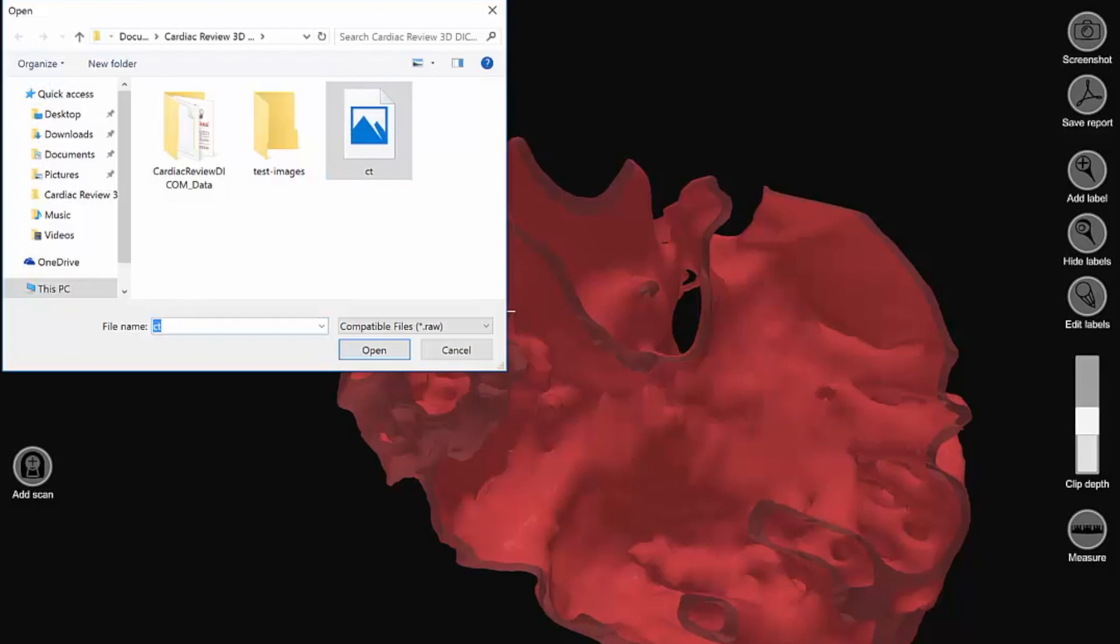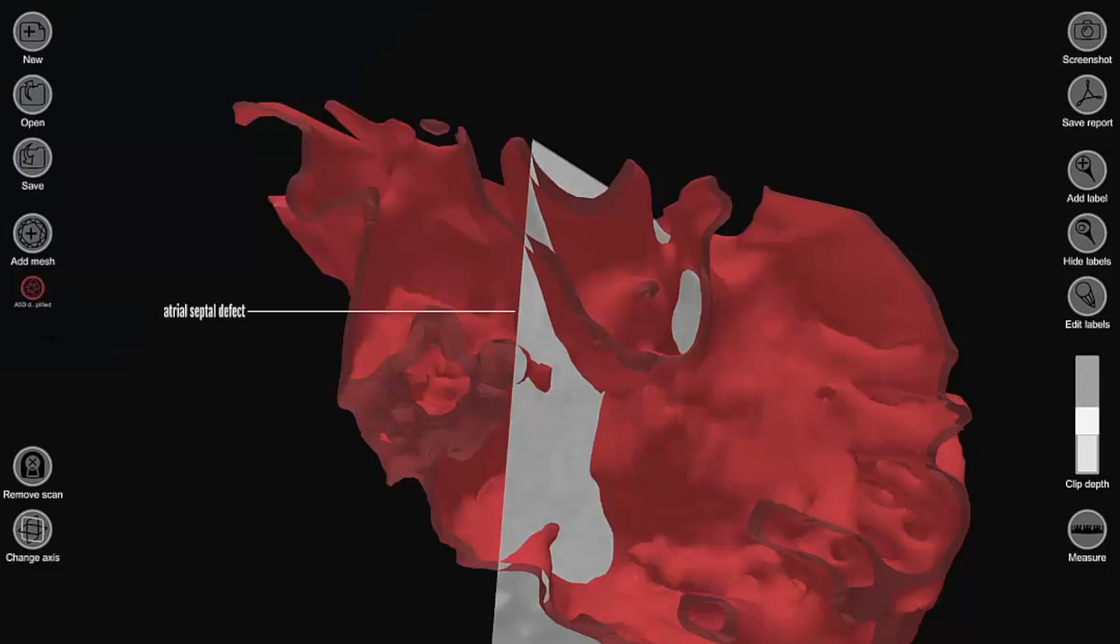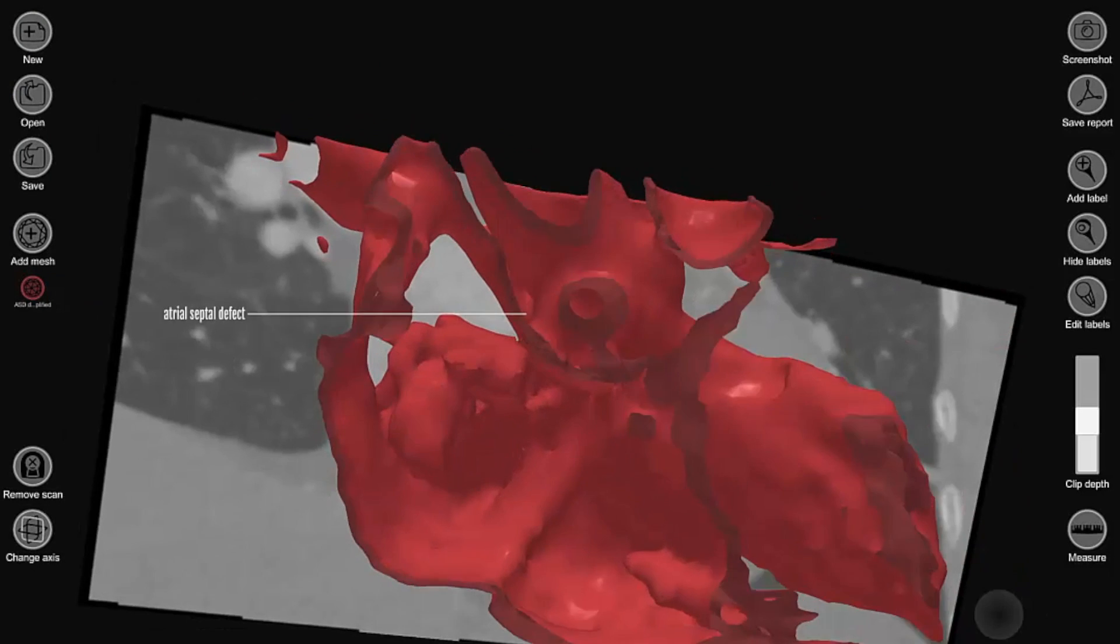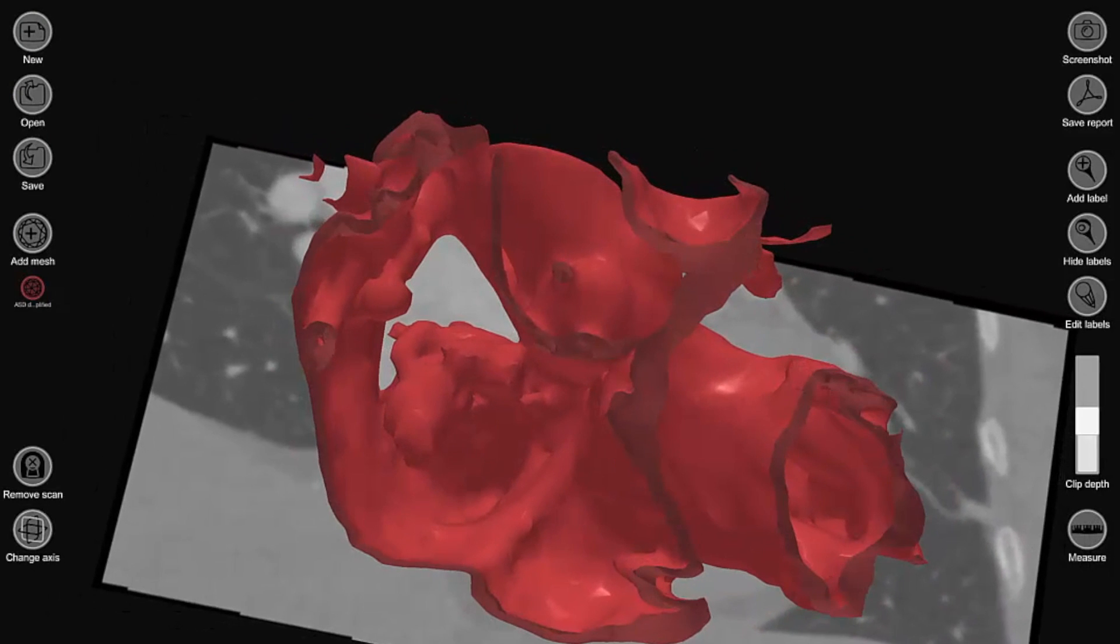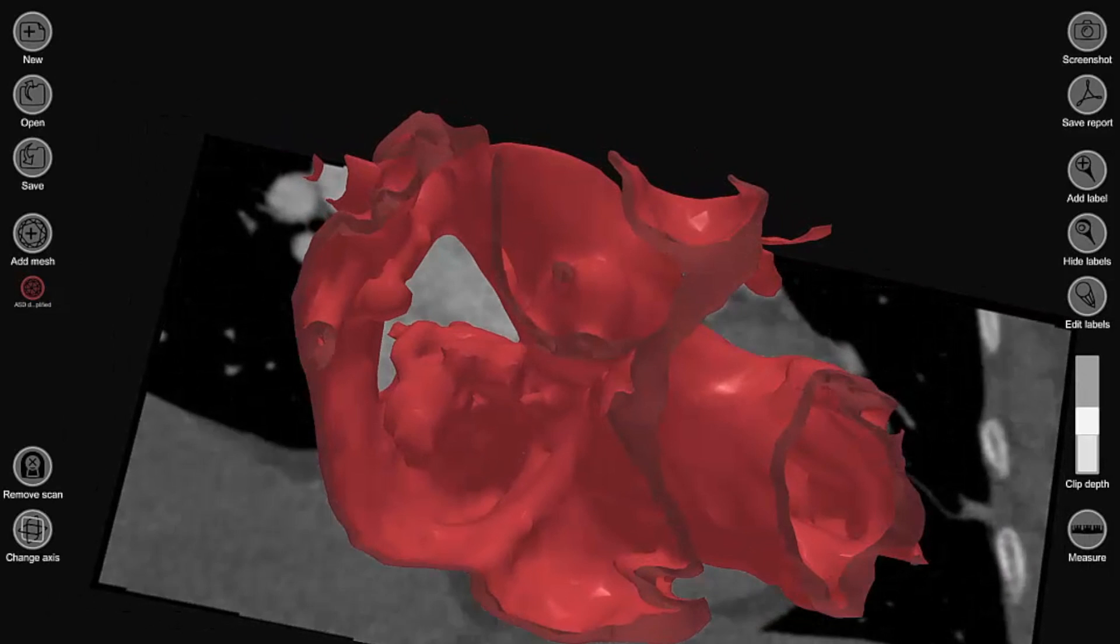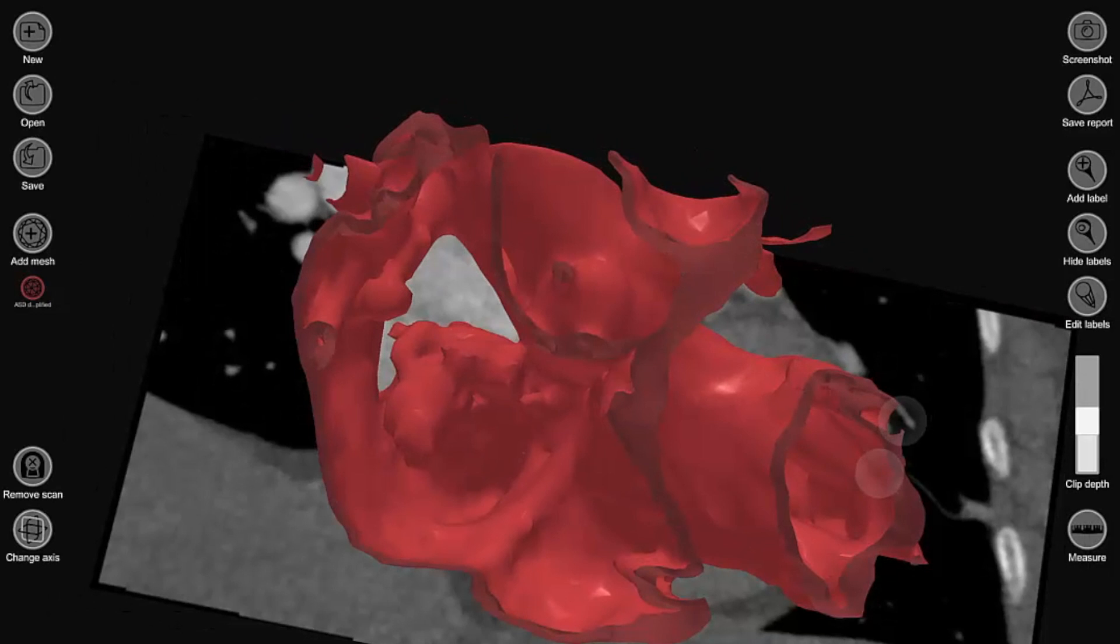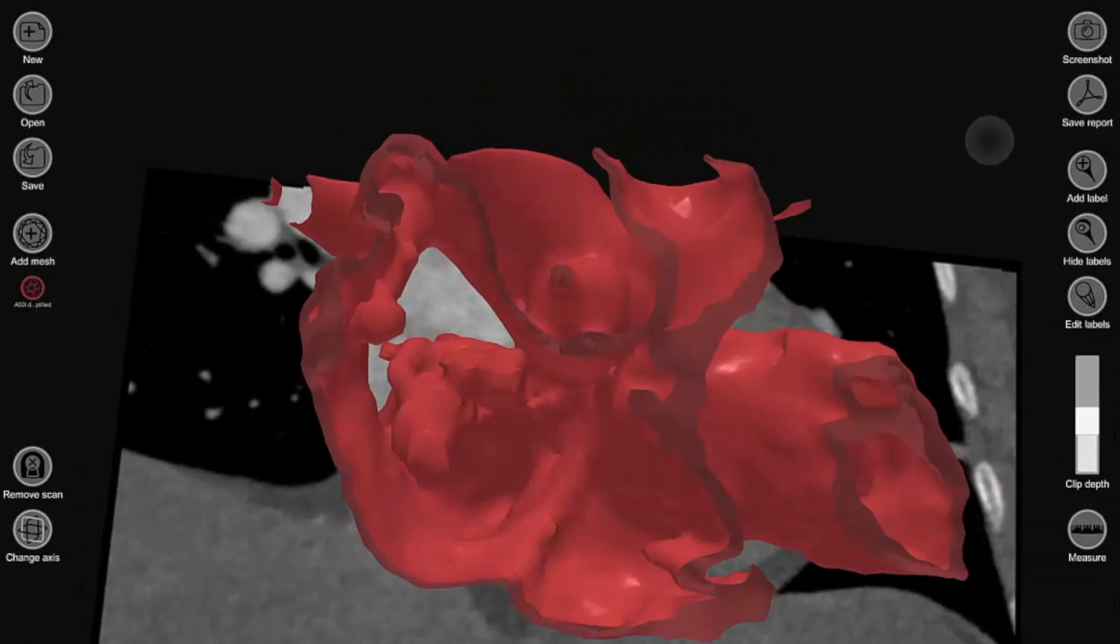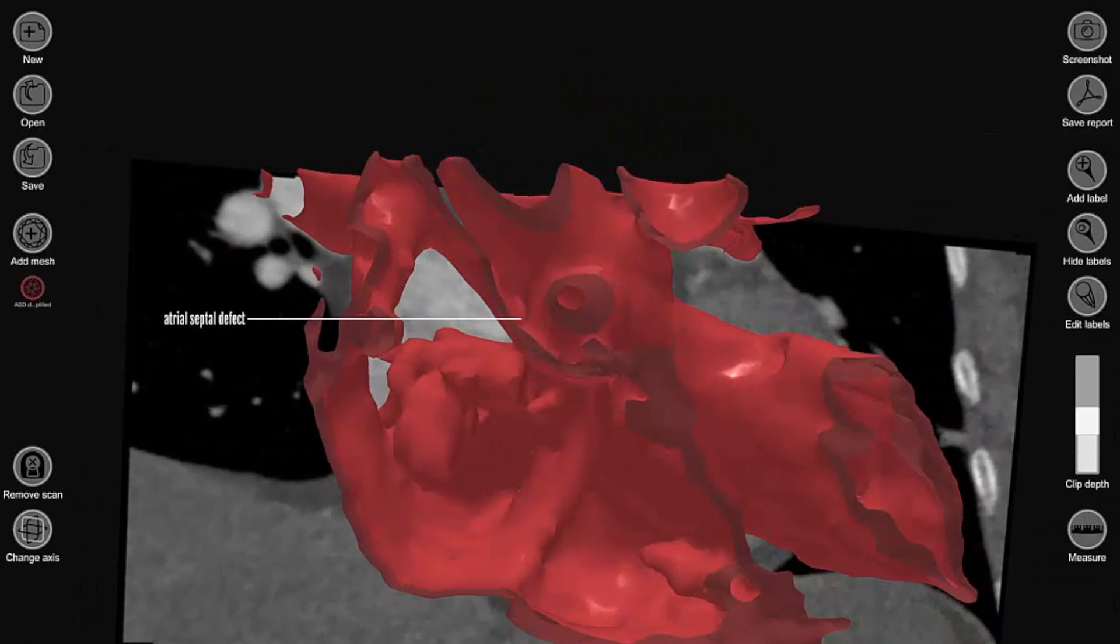In this case, this model of an atrial septal defect was created using a cardiac computed tomography imaging as a roadmap. So here we've loaded up the actual medical images as a background for the 3D model. This helps researchers and clinicians alike understand the defect in great detail.